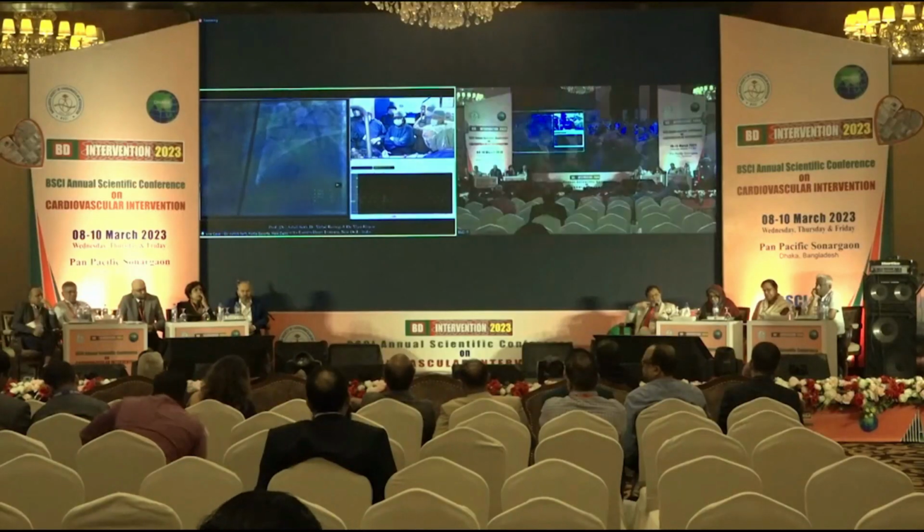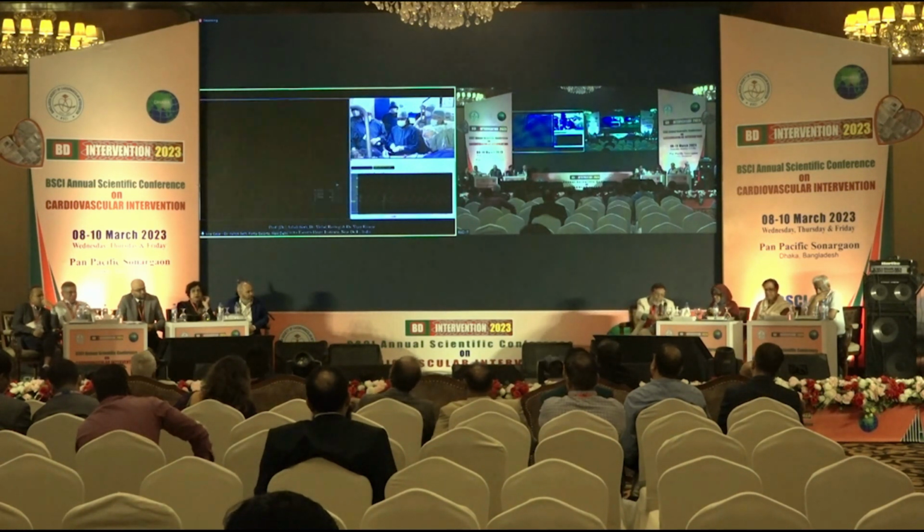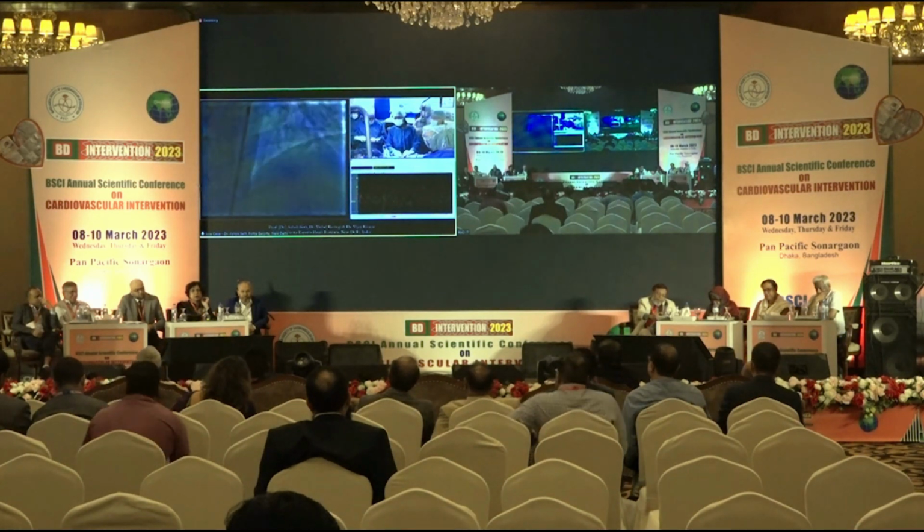And he was by this time having ectopy. He started getting VT. And now we've opened it up, so that's why he's much more stable. Okay, we'll just bring it back slightly. Can I go to the RAO caudal projection? Always look at the IVL in two different projections.